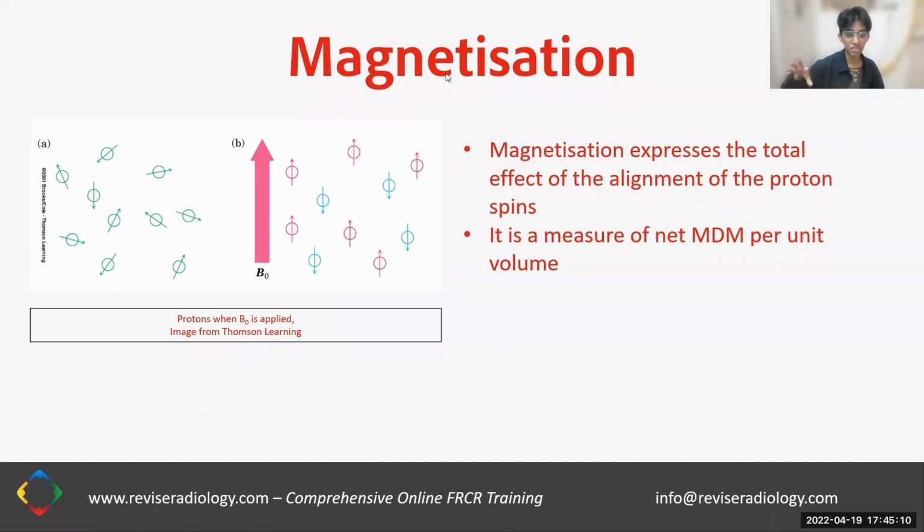So I'll just repeat the question. If each pink proton in the image contributes +1 to the magnetization, and each blue thing contributes -1, so please put in the chat box what is the total magnetization. So I'll just wait while you do that.